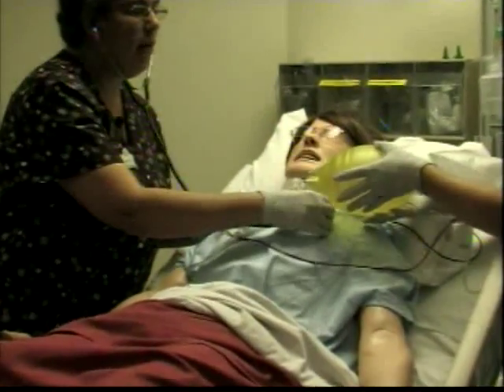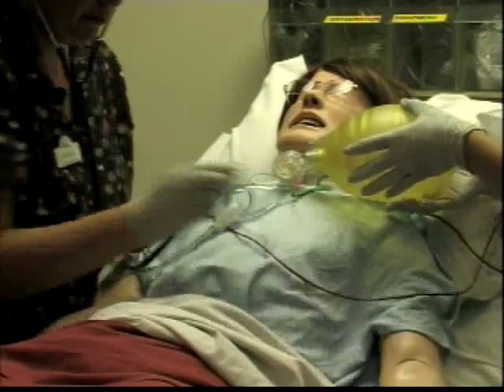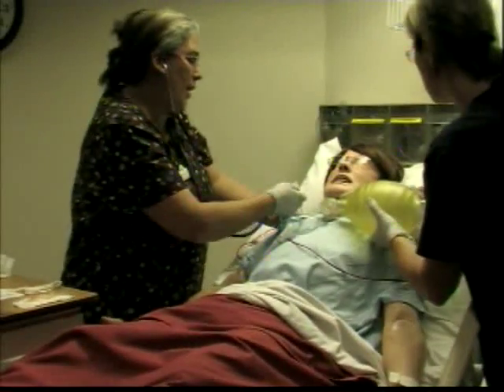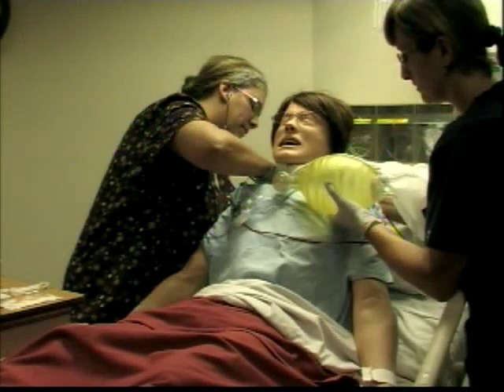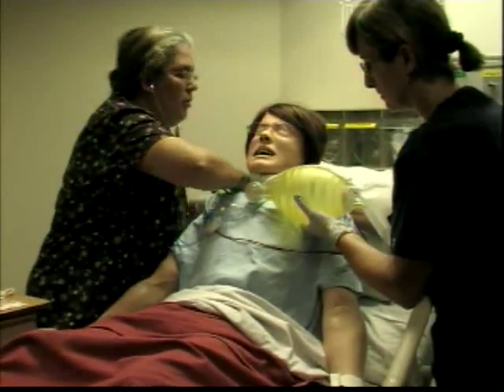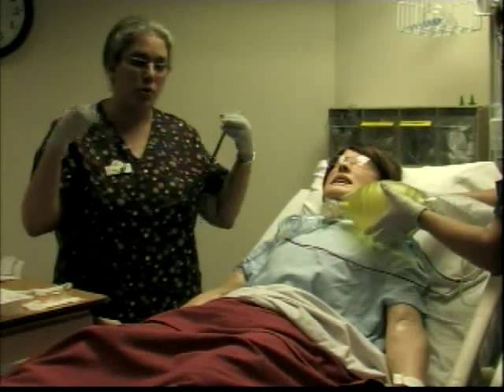Listen for a full cycle. And then I will turn her over to the side, or ask her to lift up a little bit so I can listen to her lungs in the back. I'll do that in all the anatomical places that I mentioned before. And she has a little bit of rhonchi. I can hear a little bit of the secretions in the upper airway, so that's what we're going to remove.